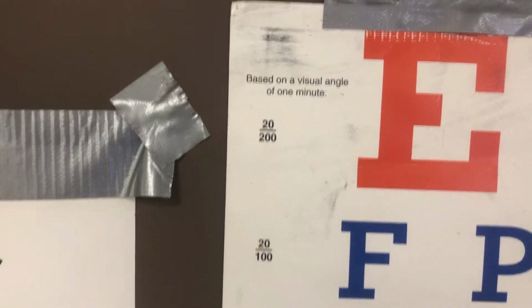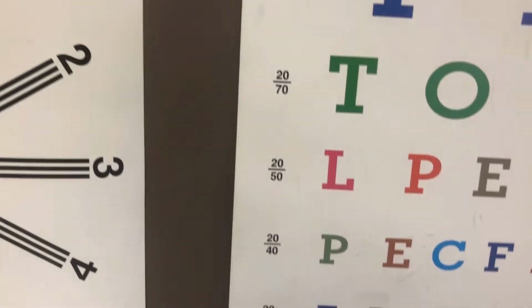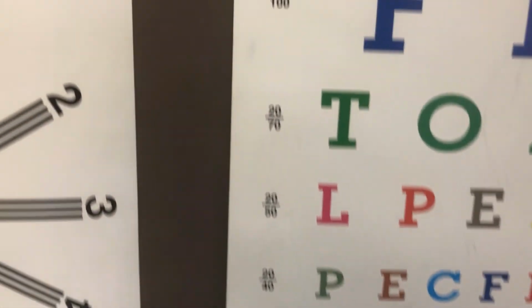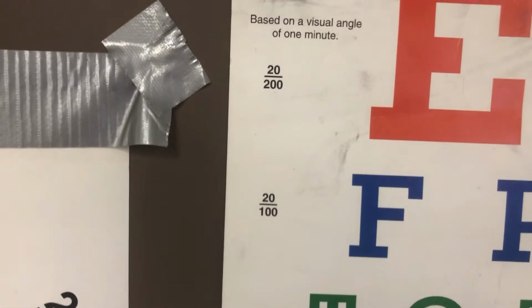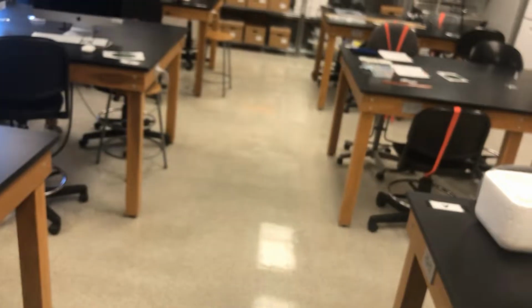A quick note about visual acuity tests. If you look at the number on the left of each line here, we're not talking about the astigmatism, we're talking about the visual acuity test. The top number is the number that the patient sees because we're measuring at 20 feet. So that orange line back there is approximately 20 feet. It's not exactly 20 feet, but it's close enough.